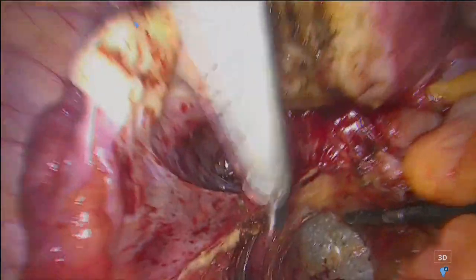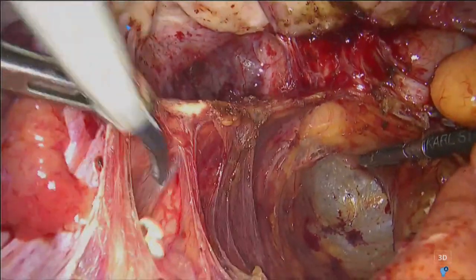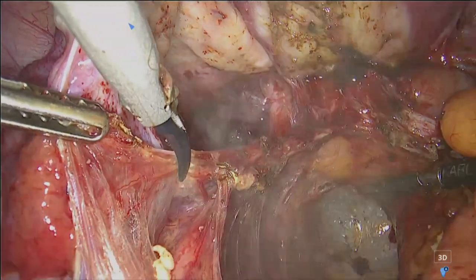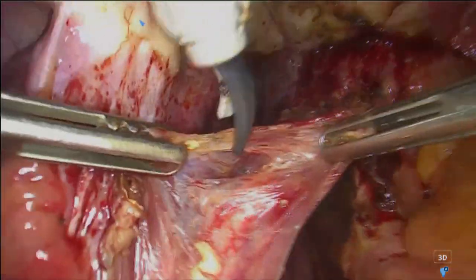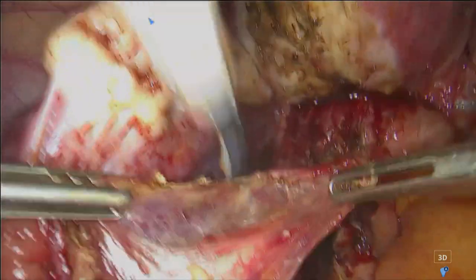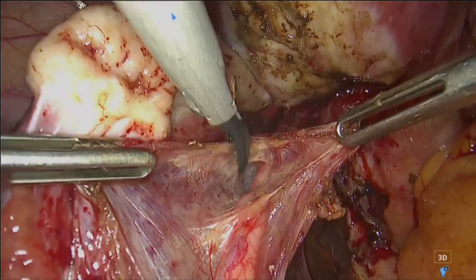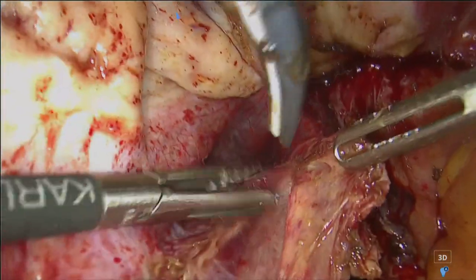And so this is the direction of the ureter here. You see, so I can start, if I want to remove the part of this peritoneum that is infiltrating around the ureter, I have to prepare laterally the tissue in order to remove all this tissue around the ureter. So this is the so-called ureterolysis. We need to start from the cranial part going down and down. Okay.